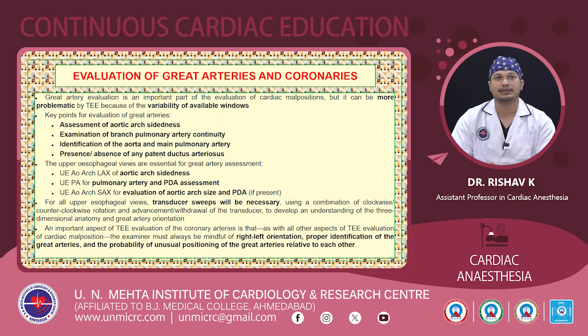So mostly we have to use here the upper esophageal views, that is the upper esophageal arch long axis view for determining the aortic arch sidedness, the upper esophageal pulmonary artery view for the pulmonary artery and PDA assessment, and the upper esophageal aortic arch short axis view for evaluation of the aortic arch size and the PDA if present. For all the upper esophageal views, transducer sweeps will be necessary. That is, not just one view, but we have to move the transducer and determine the continuity of each of the cardiac structures using a combination of clockwise, counterclockwise and advancement withdrawal of the transducer to develop an understanding of the three-dimensional anatomy.